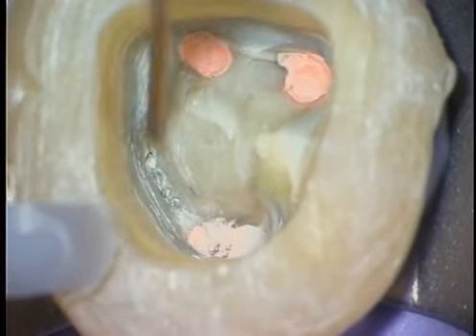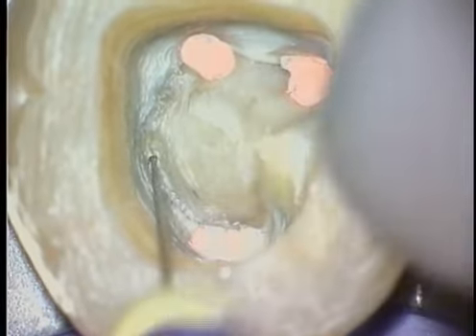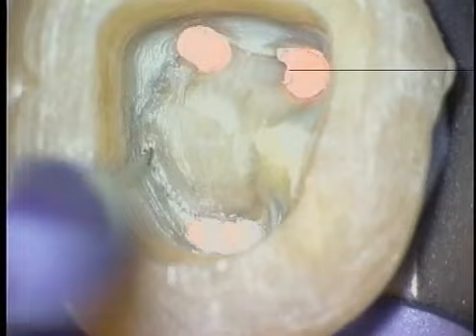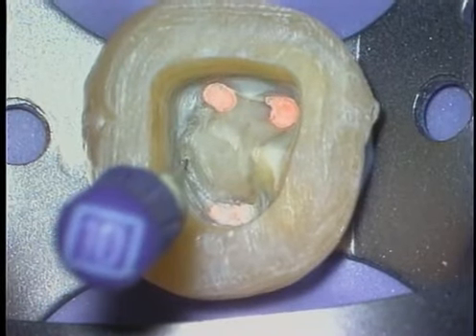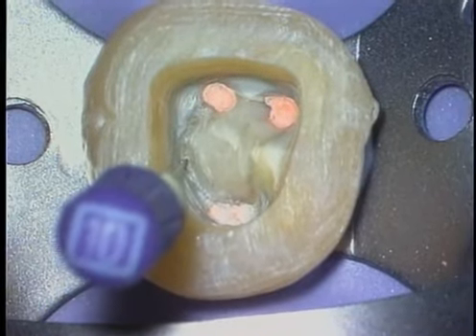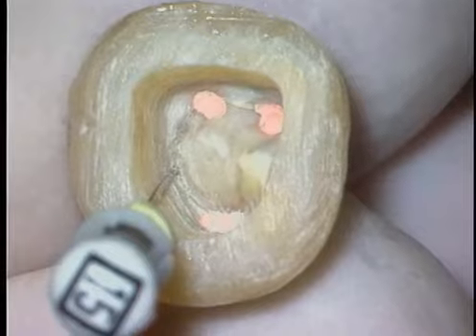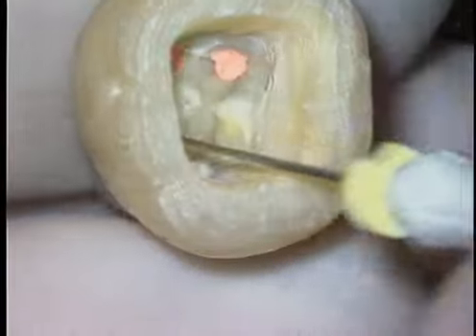Because the C-shaped molar has a deep pulp chamber, which is usually subcrestal, it's a long distance from the occlusal table to the pulpal floor. In the instance of a vital case, blood may be emanating from the midst of the pulpal floor, giving the clinician insecurity as they may think they've inadvertently perforated the floor of the tooth. Working instruments along this sheath of pulpal space or tissue can sometimes be a little bit daunting in that you're not sure necessarily where the instruments are. Apex locators are useful, but radiographs are best for confirming the position of the file within the root of the tooth.